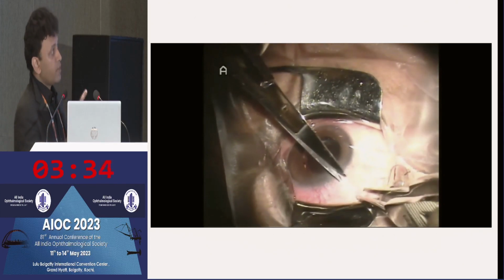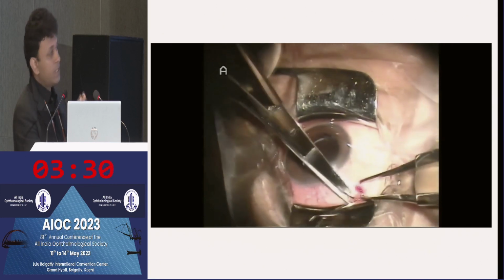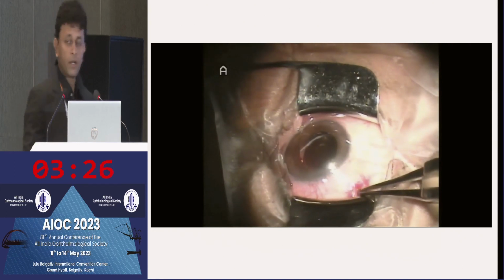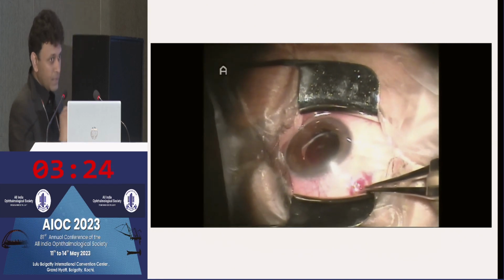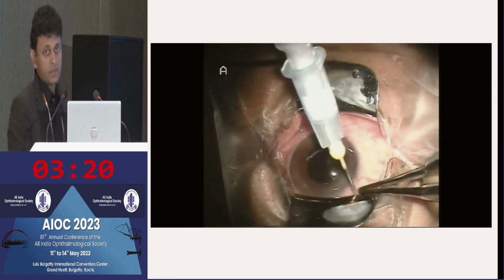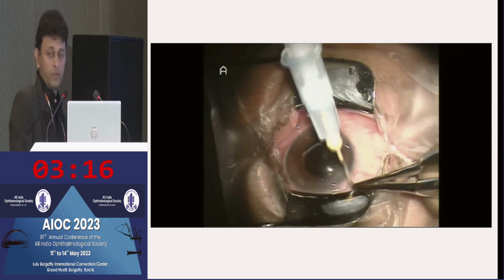So what we generally do at our center is a conjunctivotomy and a tenotomy, and we use a viscocannula to inject triamcinolone exactly in the subtenon space. This technique has two advantages. One is you avoid inadvertent perforation of the eye because of the use of a needle.